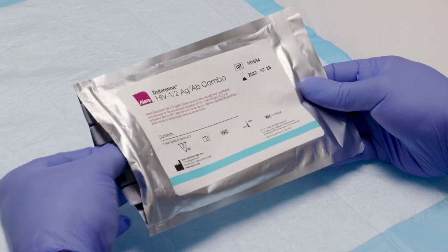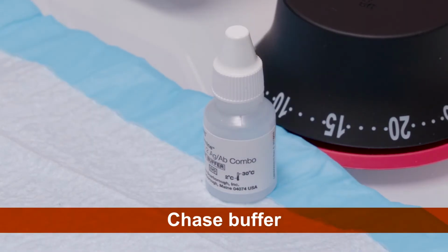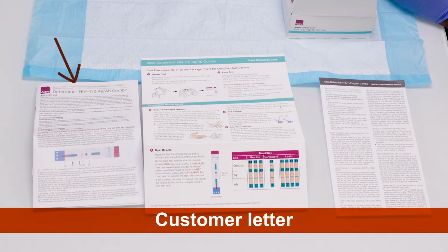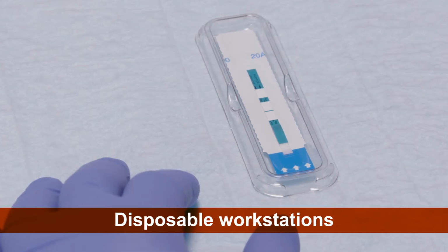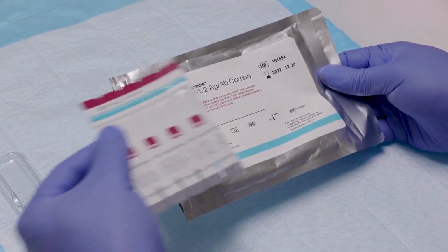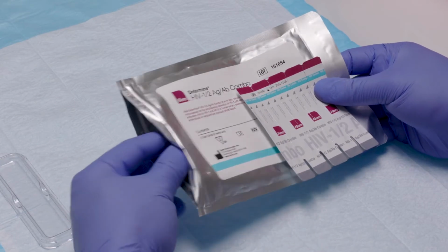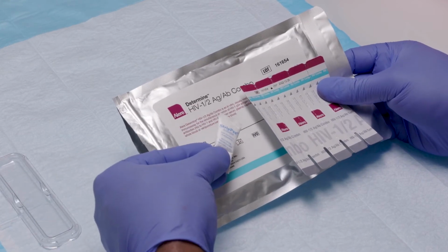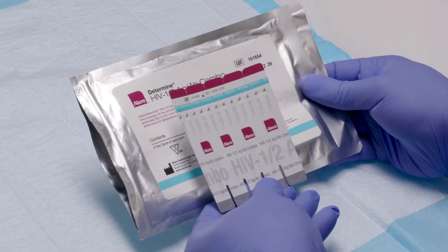The test kit contains an aluminum pouch with test strips, chase buffer, a quick reference card, information notices, a customer letter, disposable capillary tubes, and disposable workstations. These workstations hold the test strip. Open the aluminum pouch containing the test strips. Feel for an absorbent packet inside the pouch. If the absorbent packet is missing, discard the test strips and start over with a new pouch of test strips. If the absorbent packet is present, remove a card of test strips from the aluminum pouch.